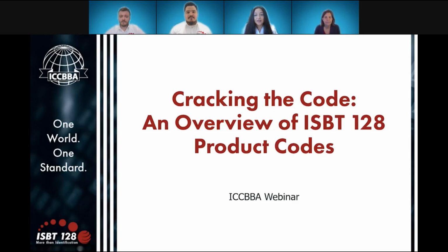Thank you, Ryan. Ryan, I have another question for you. What is a reference table? Yeah, of course. A reference table provides encoding values and their corresponding descriptions or definitions. These encoding values can be found within ISBT 128 data structures. For instance, the first 5 characters of the product code data structure is the ISBT 128 PDC.